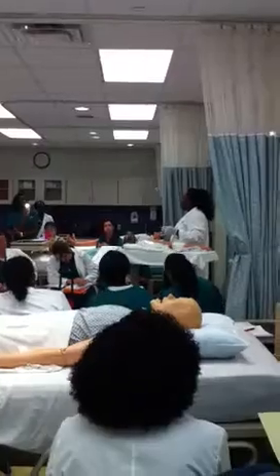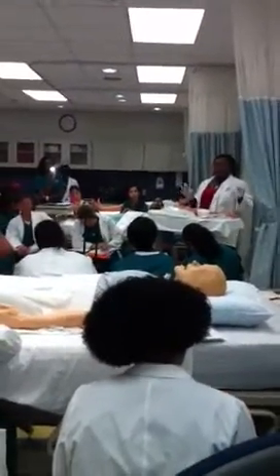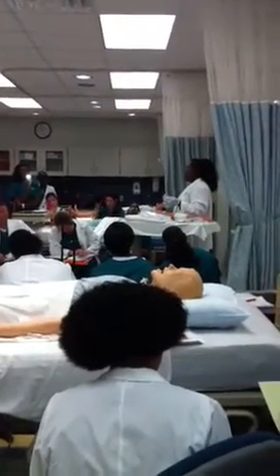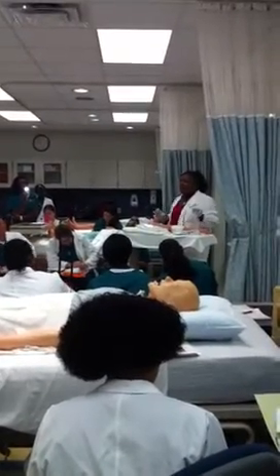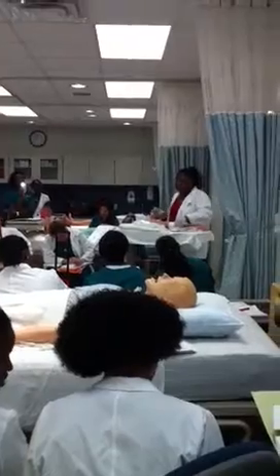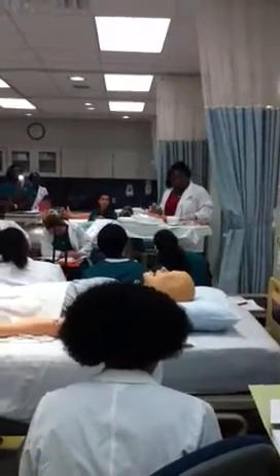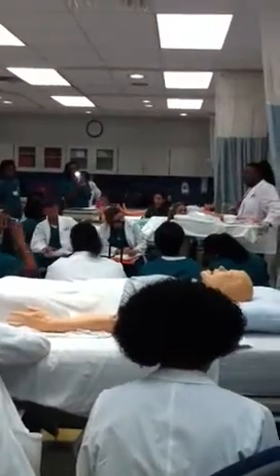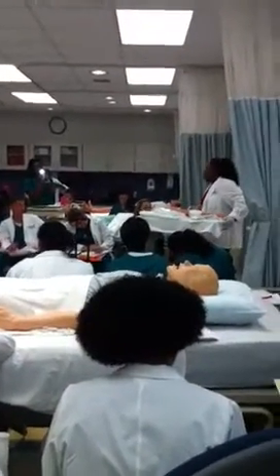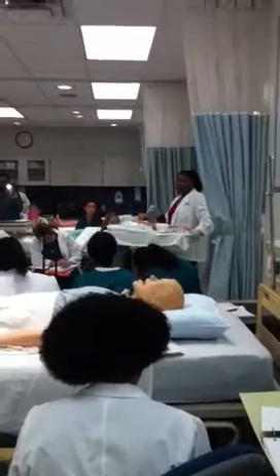That's all you need to do for sub-Q. Any kind of sub-Q, that's the route. That's the way you administer it. Again, there are so many body areas where you can administer it. Your Picture Perfect in the book will tell you all the appropriate sites in your body for sub-Q and the appropriate sites for IM. All right, I'm done.